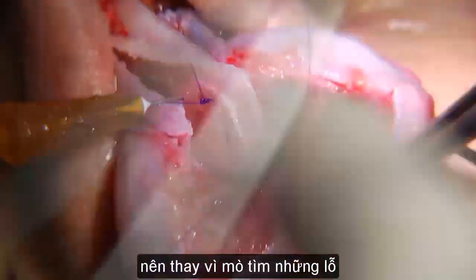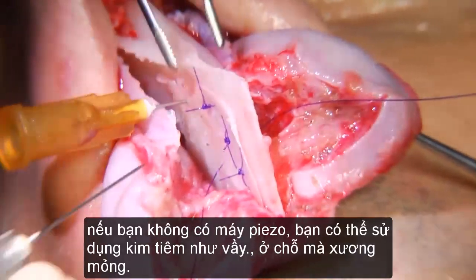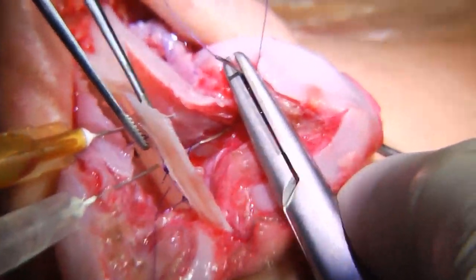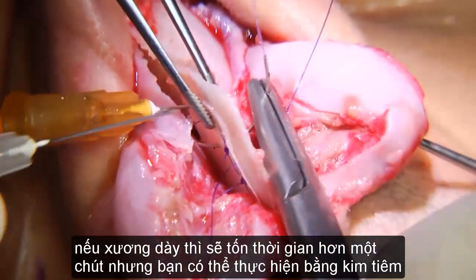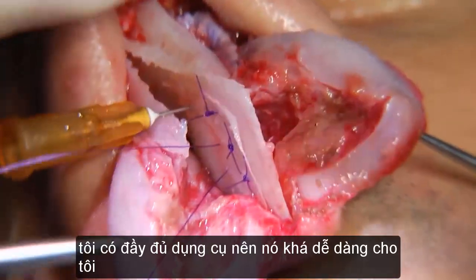So instead of finding this hole blindly, if you don't have this, all you need to do is do this, all right? And where the bone is thin, sorry, if the bone is thick, you need some time, but you can just do it with a needle. I have this instrumentation, so it's easy for me.